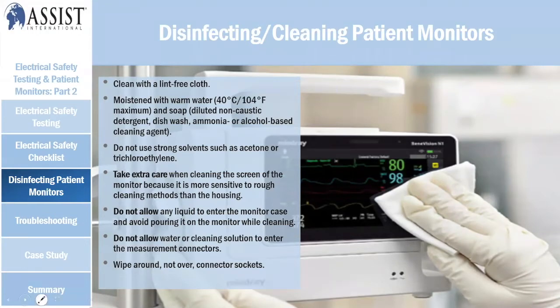Always remember when you're wiping your medical device, always avoid liquid entering the monitor. Clean it, let it dry. We don't want any water or solution entering into the medical device. So wipe around the connector with a dry cloth, dry material, and the connector socket should be dry. We don't want any moisture or water entering that particular part.